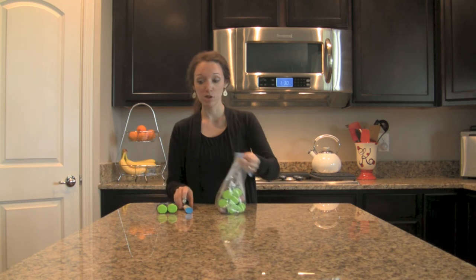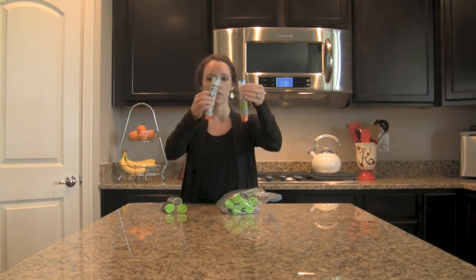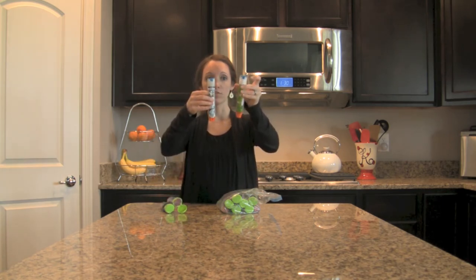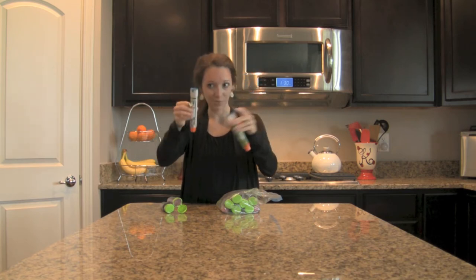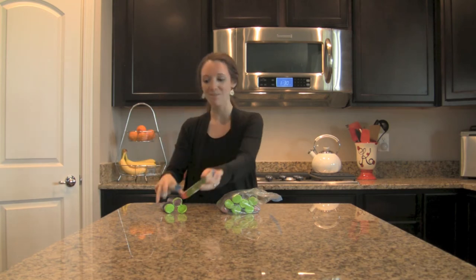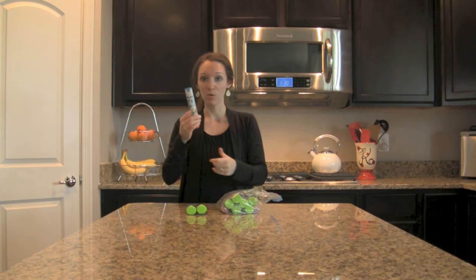All two-packs of EpiPens do come with a training device — it looks very similar to the actual EpiPen, almost identical. This one has a little bit more clear on the top. If you are training with the training device, make sure you have the training device — it says 'training device' up top. Because if you're training on yourself, there's nothing worse than a surprise injection of epinephrine.